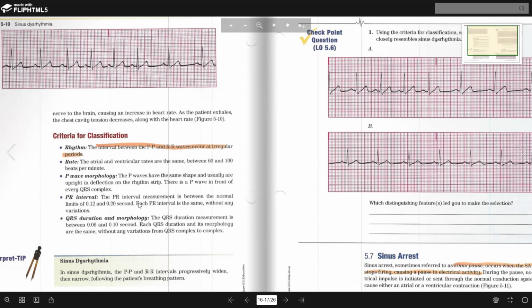Is it A, sir? Hold on. So we're talking again, why do we have sinus dysrhythmia? Because of the vagal nerve. Okay. When you breathe in and breathe out, I think one of you was doing the EKG, right? And we saw this. When they're breathing, you see a change in the EKG pattern. So when you perform an EKG, you make sure that you capture when the person is maybe not breathing for that 1 or 2 seconds when they're calm, and then take a picture.